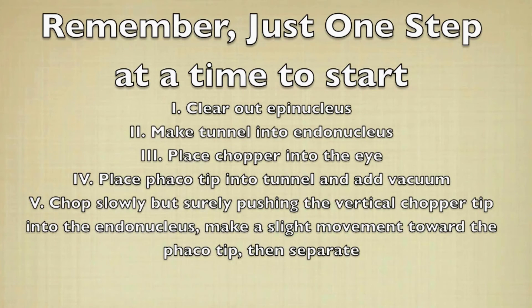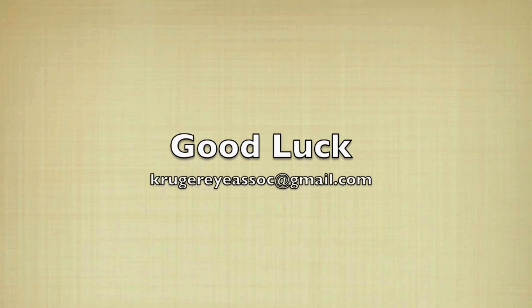So remember, just one step at a time: clear out the epinucleus, make a tunnel into the endonucleus, place the chopper into the eye, then place the phaco tip into the tunnel and add vacuum. Chop slowly but surely, pushing the vertical chopper into the endonucleus, then do a slight movement towards the phaco tip and then separate. I hope you learned some good points on vertical chopping and I wish you good luck. Go ahead and email me if you have any questions at the address seen on the screen.